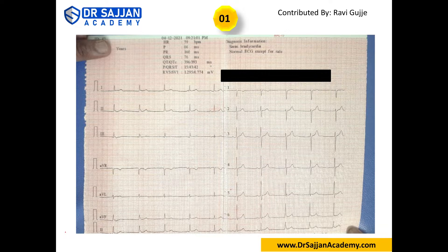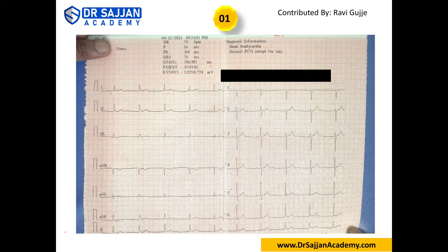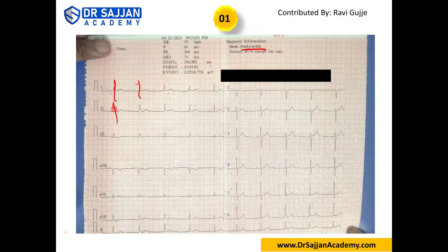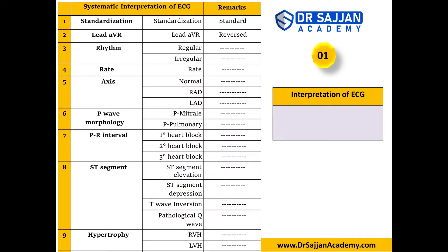Left ventricular hypertrophy is also not present. Coming to bundle branch block — there is no wide QRS complex, so bundle branch block is ruled out. This is essentially a normal rhythm — normal sinus rhythm. There could be some junctional irregularities, but looking at the ECG, the only finding here is possible borderline bradycardia. Calculating exactly: one, two, three, four, five — exactly 60 beats per minute. Bradycardia is below 60, so this could be borderline bradycardia.